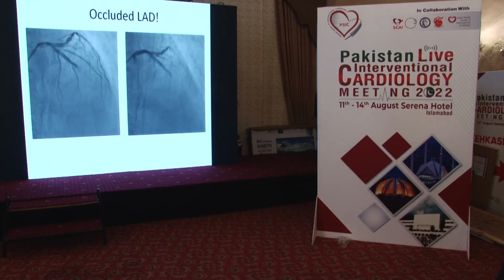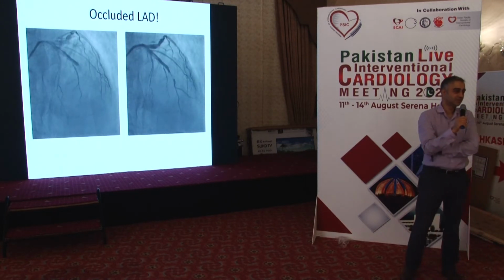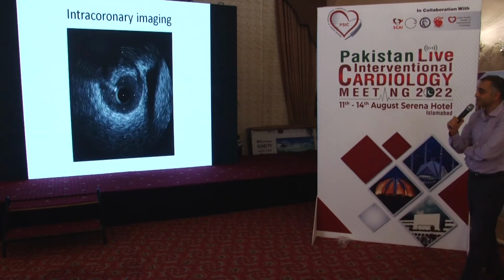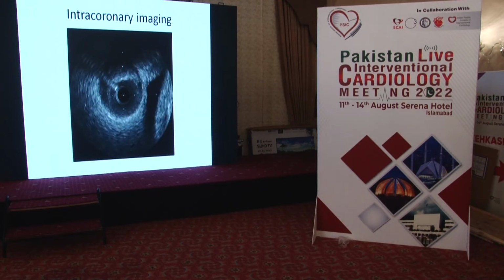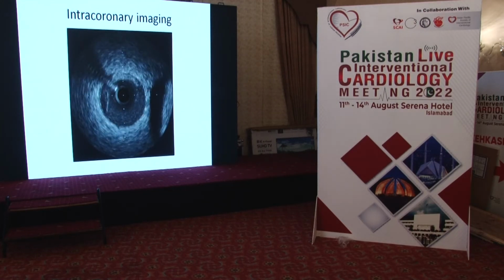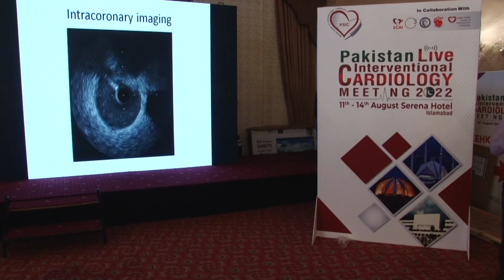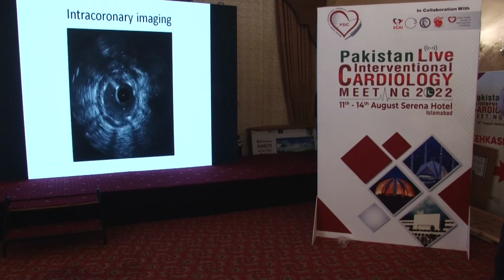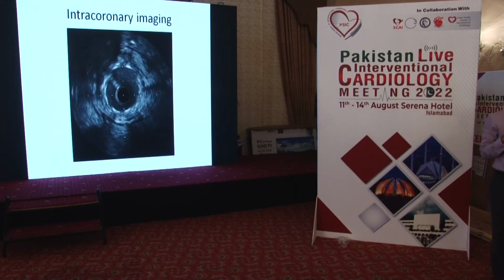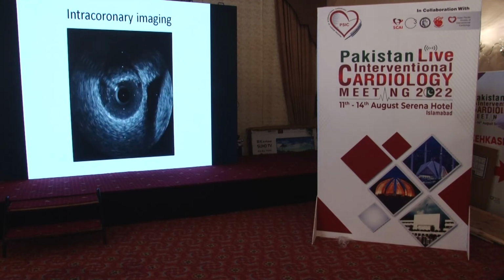Yes, good. You're in the right session. So, this is a prime example of where you'd want to use an imaging catheter to try and work out what's going on. So have a look at the IVUS run. Yes. So it's quite obvious now. This was the earlier still that you saw. So you can see this sort of flap around 6, 7 o'clock, sort of waving at you. That's the edge dissection. So there's obviously a tear in the artery, and this is coming into the stent. So it's just at the distal end of the stent.